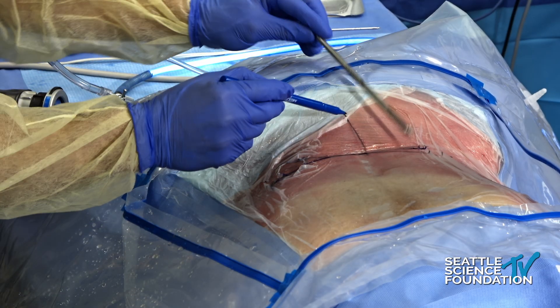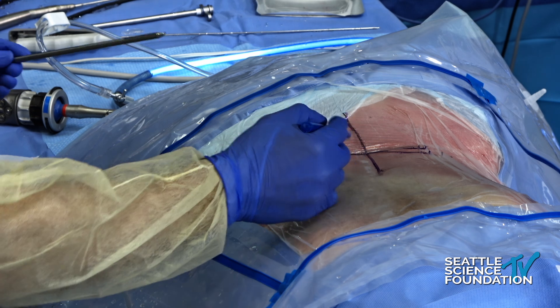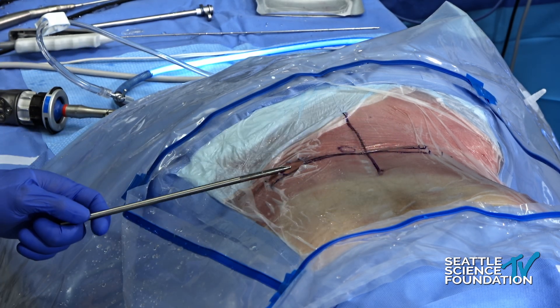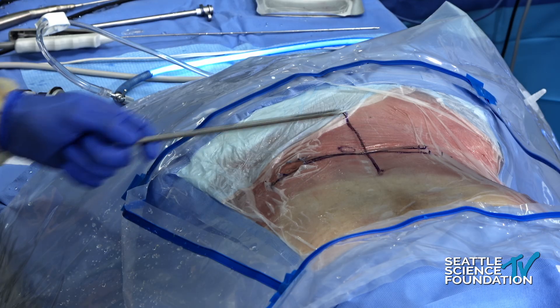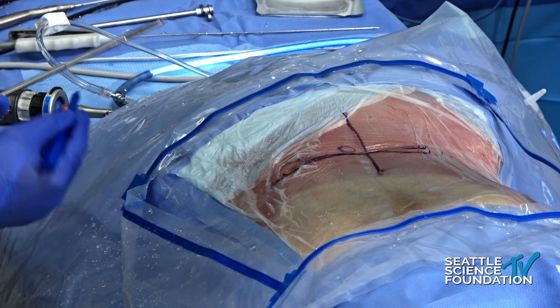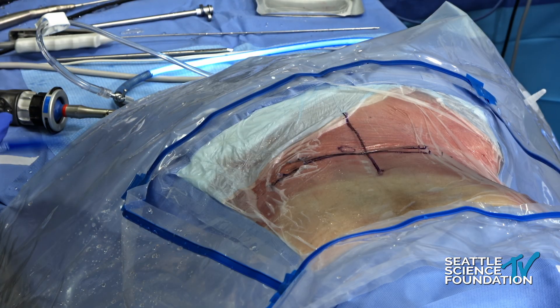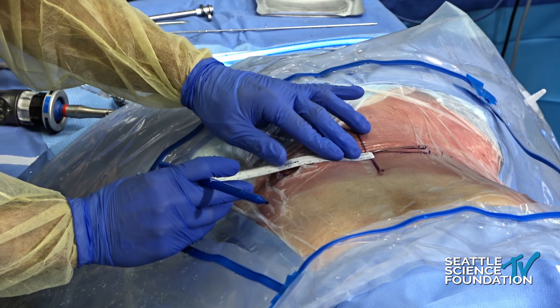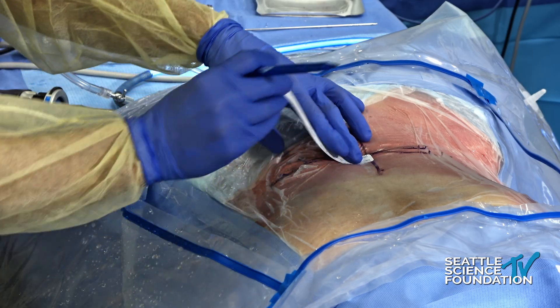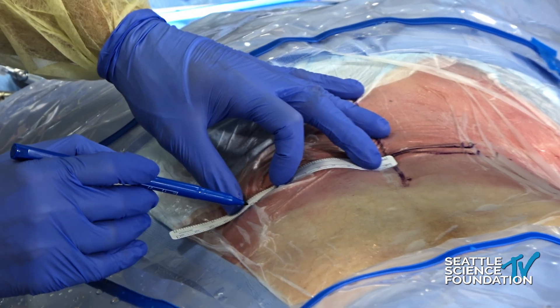Just to review: we have our midline here, the cranial aspect of L4, our pedicle, and that's the trajectory. Meng started about six to eight centimeters lateral to the midline. We're going to start further lateral to get a little bit more medial. I would plan all of this based on preoperative MRI axial cuts, but we don't have that luxury here. He started at about eight — I'll start at eleven centimeters.